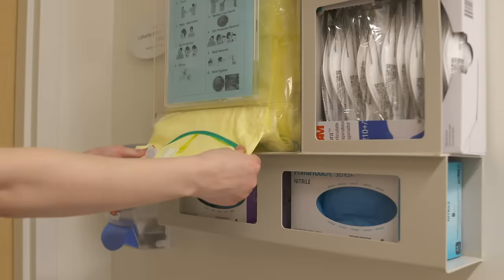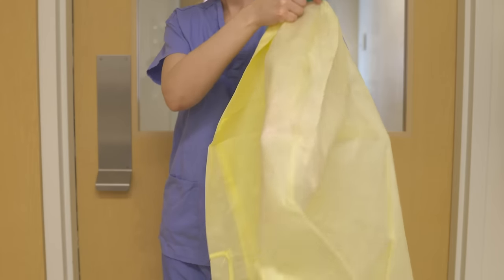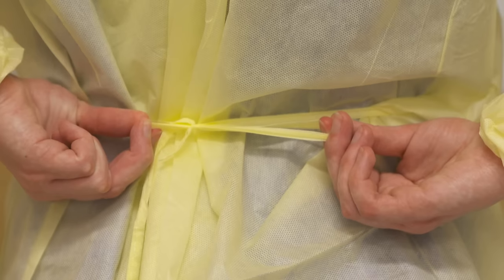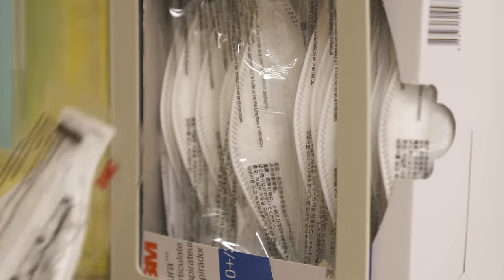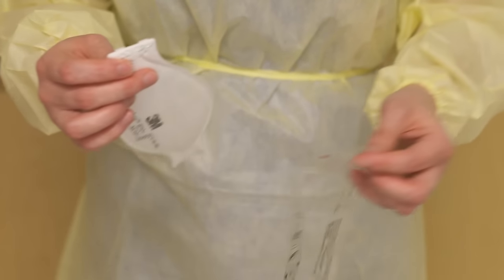These are the steps for donning and doffing PPE. If at any time you feel that you have made an error, please use hand hygiene between any of the steps or wash any area that has been mistakenly exposed.